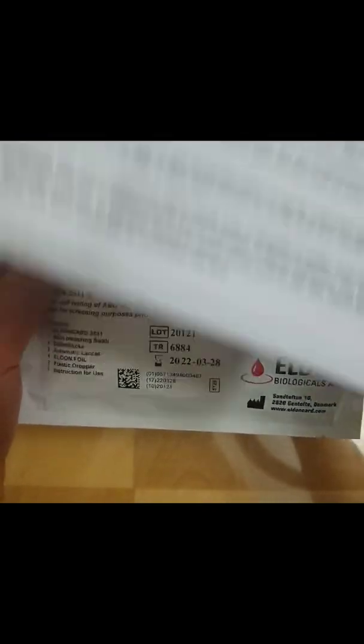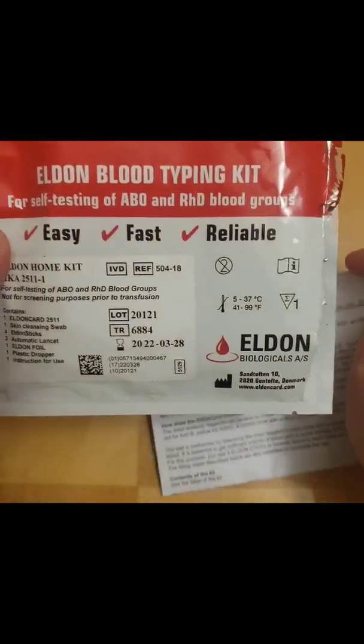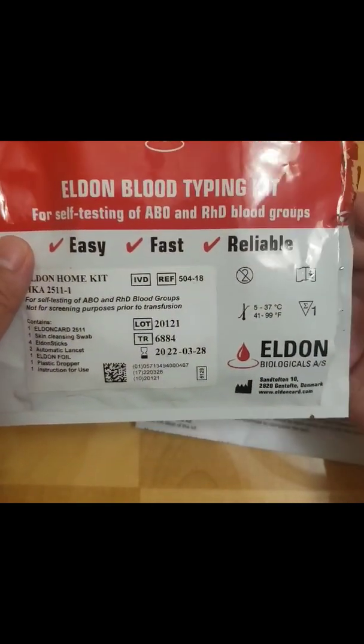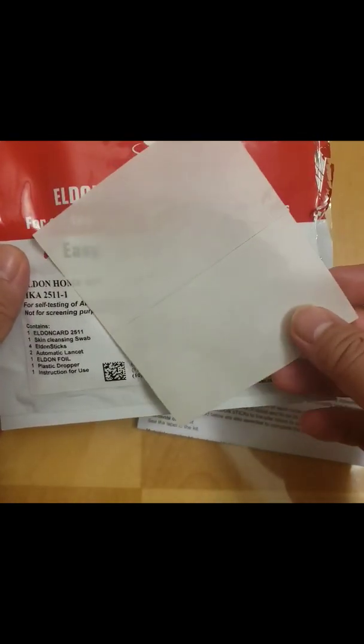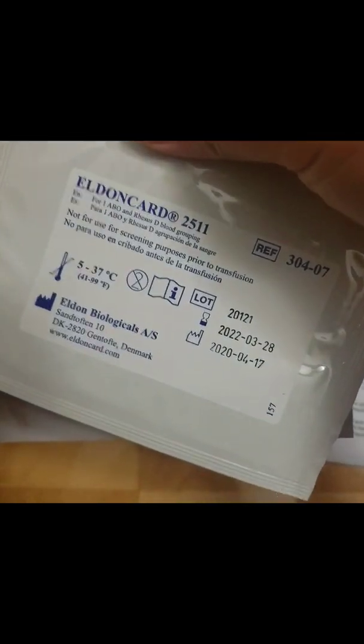This is called the Eldon Card, and I bought it online for only ten dollars. The Eldon kit includes instructions, Eldon foil, and the Eldon card.